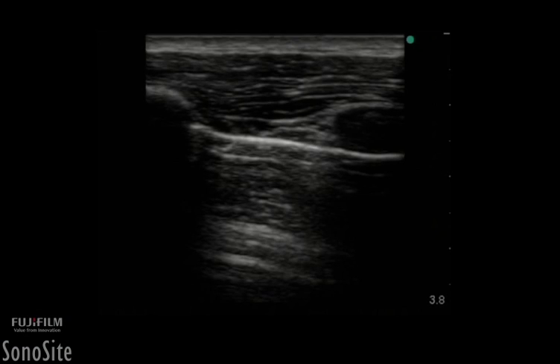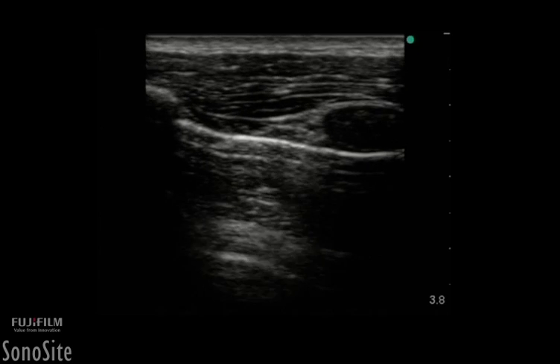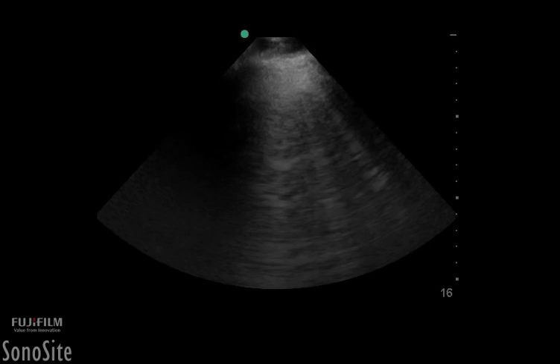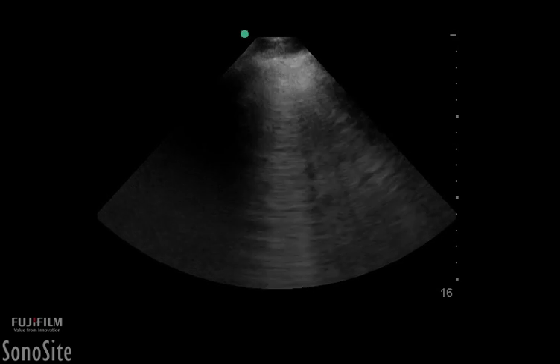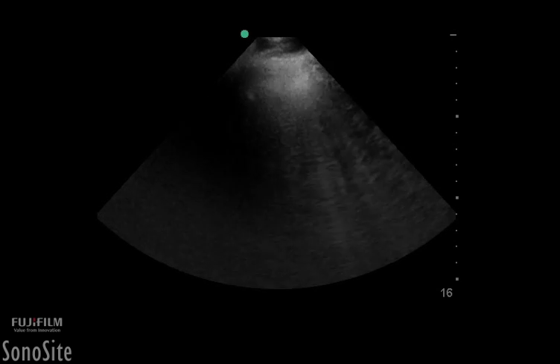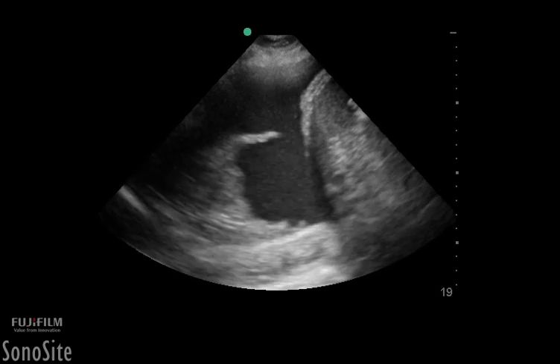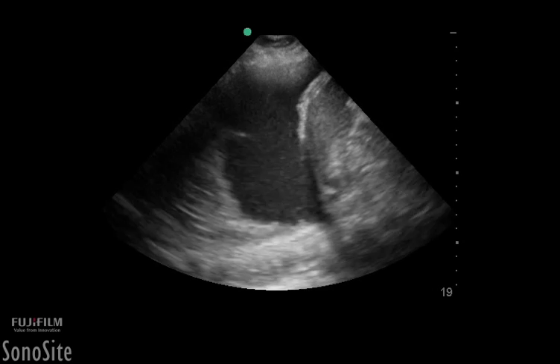These are: 1. The utility of ultrasound to evaluate for the presence of a pneumothorax. 2. The use of ultrasound to detect and quantify the severity of lung parenchymal disease. And 3. The ability of ultrasound to detect and quantify pleural effusions. Each of these areas will be discussed.